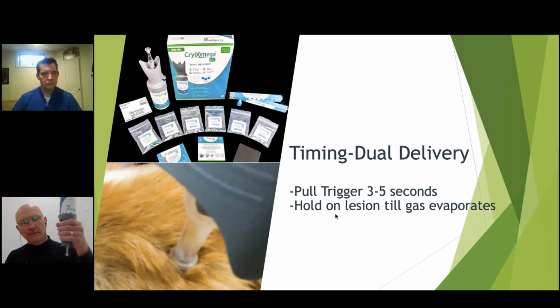We have a number of clinicians that pull the trigger correctly for the 3 to 5 seconds, but what you have to do after that is let the gas bubble underneath for up to 40 seconds it may take to fully evaporate. You don't want to lift it up after 3 to 5 seconds. That's not the actual treatment time. That's just to dispense the gas.